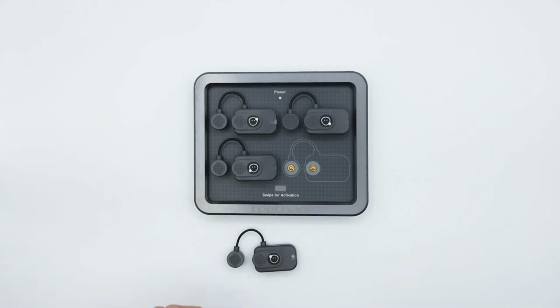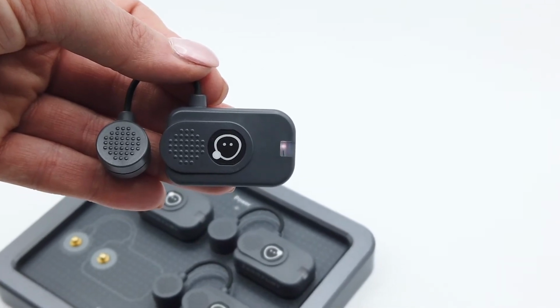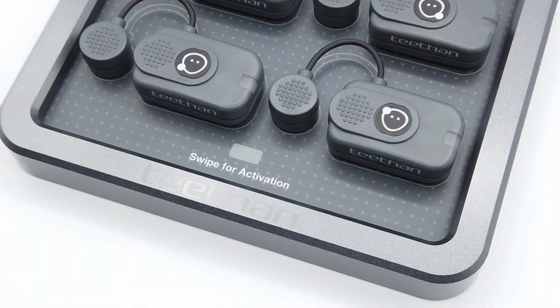If the probe is on, a white LED will start blinking very quickly. The quick blinking means that the probe is looking for the USB receiver. The LED will begin to blink slowly once the probe is connected. If the LED turns off completely, the battery is low.